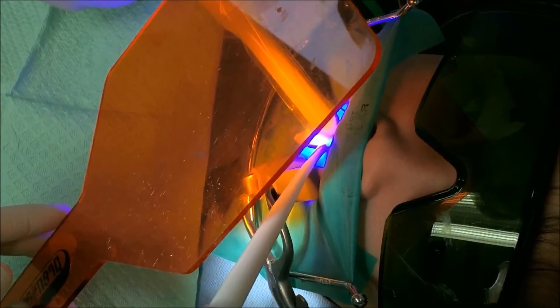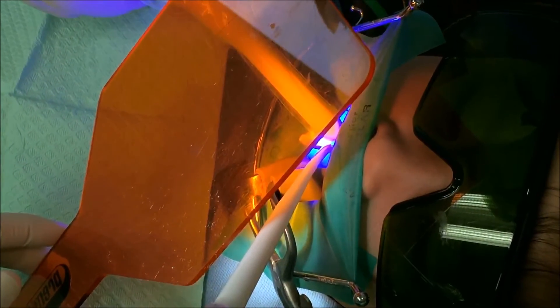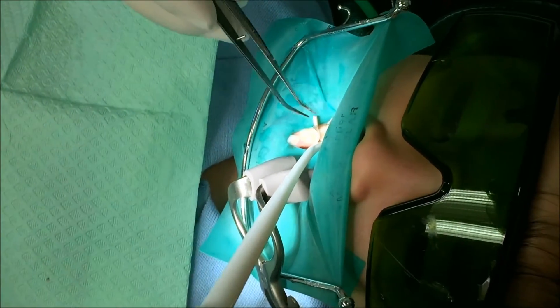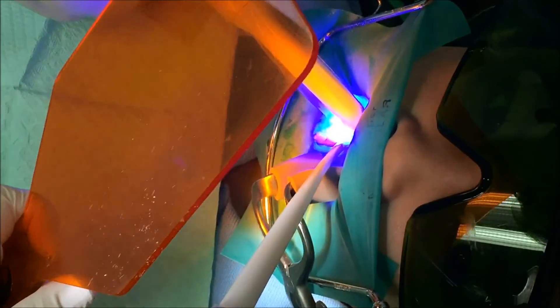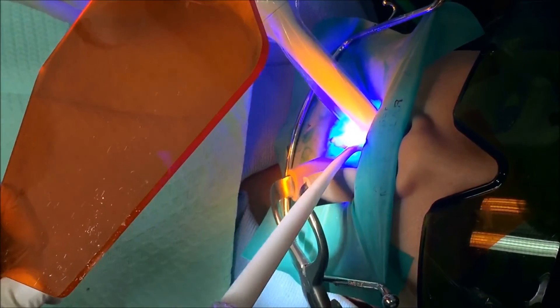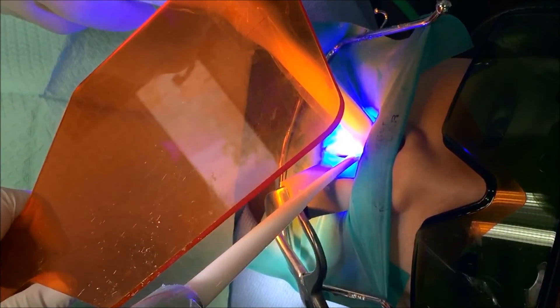30 seconds. That's 40 — I'm going to kick out the ruler; we don't need this ruler anymore. Put the light on for another 20 seconds. 10 more seconds and then we'll polish the filling and we are done.